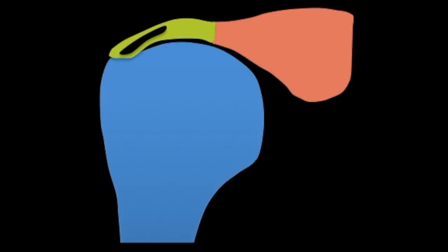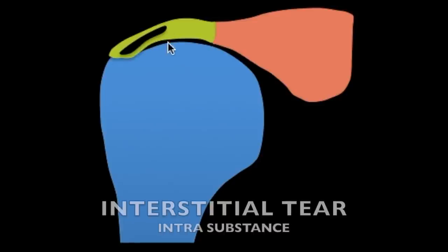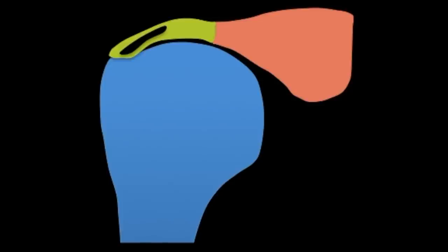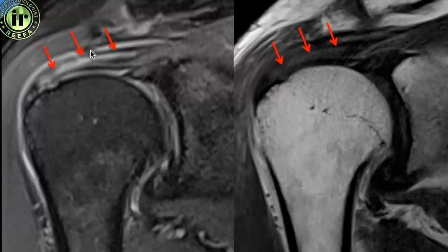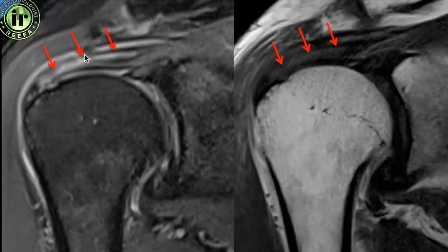In an interstitial tear, there is tearing within the substance of the tendon with both the articular and bursal surfaces intact. Because these tears cannot be seen by the orthopedic surgeon on arthroscopy, it is very important for radiologists to report them. You can identify a linear hyperintense signal within the tendon substance where the signal is as bright as the adjacent subacromial bursal fluid, confirming a long interstitial tear in the supraspinatus tendon.